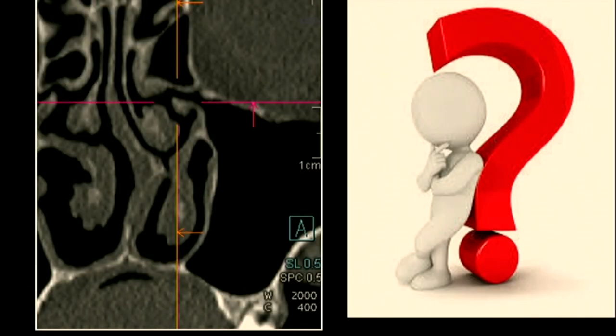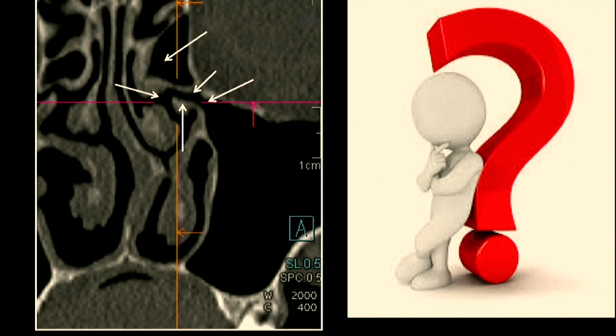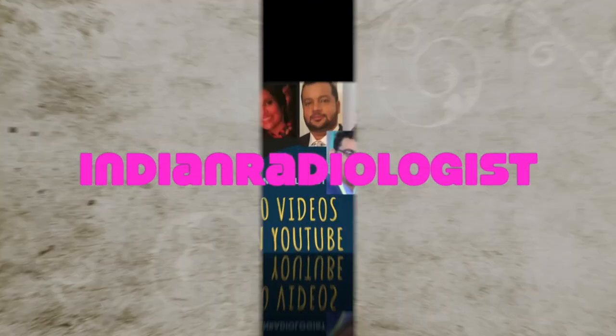To quickly delineate the main components again: this is your maxillary ostium, this is the infundibulum, this is the hiatus semilunaris, this is the uncinate process, this is the bulla ethmoidalis, and this is our middle meatus.